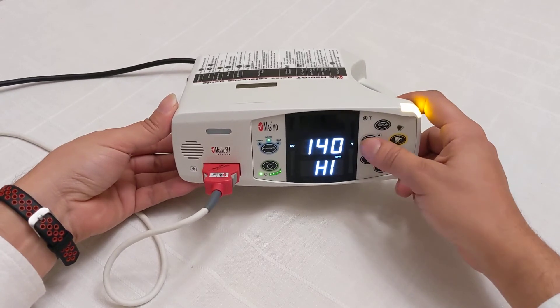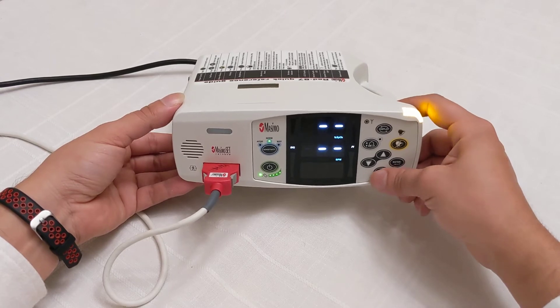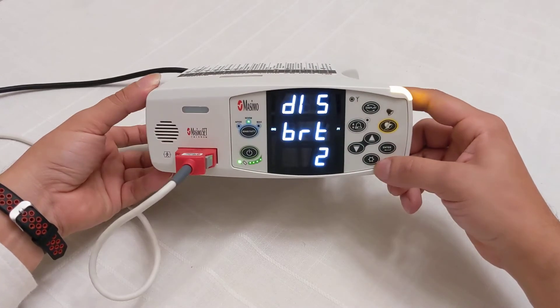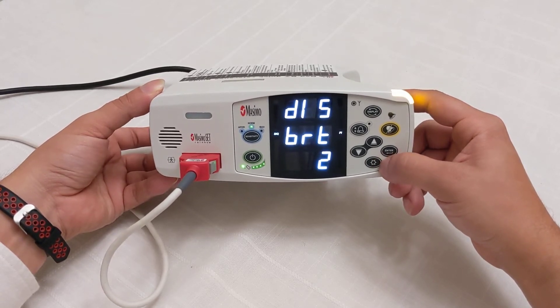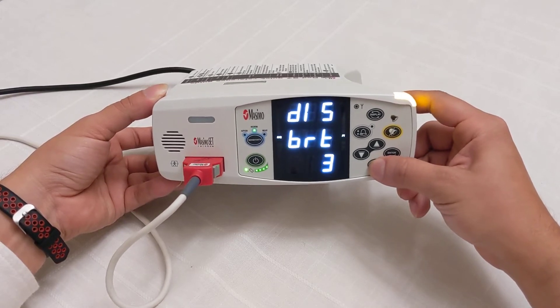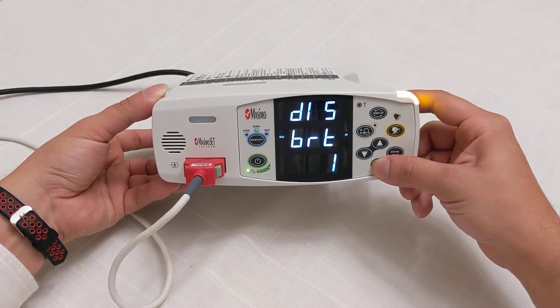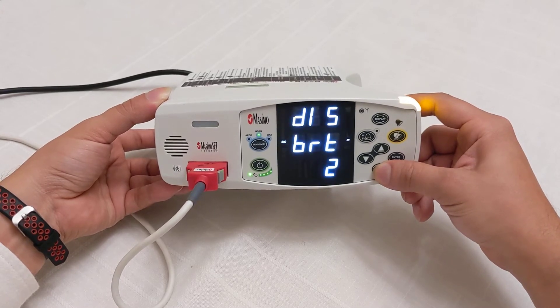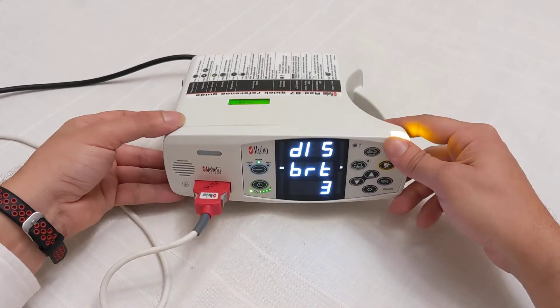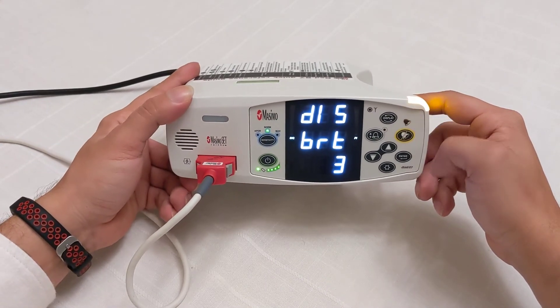Another important button is brightness. Get out of the alarm menu to return to the home screen, then adjust the brightness by clicking this snowflake-looking button — which is a bit weird, but it's supposed to represent the sun or brightness. Keep clicking and it gets brighter. It has four presets: one, two, three, and four. Keeping it on two or three is bright enough.